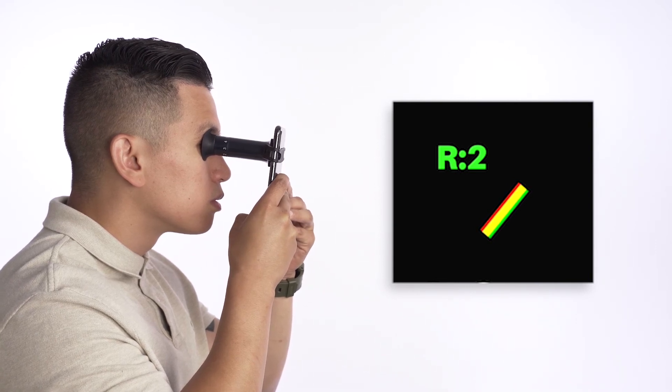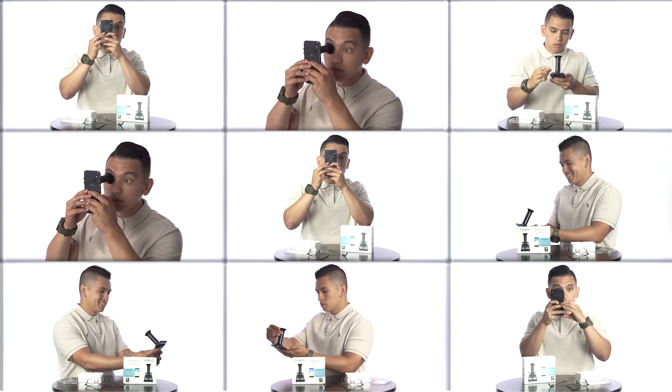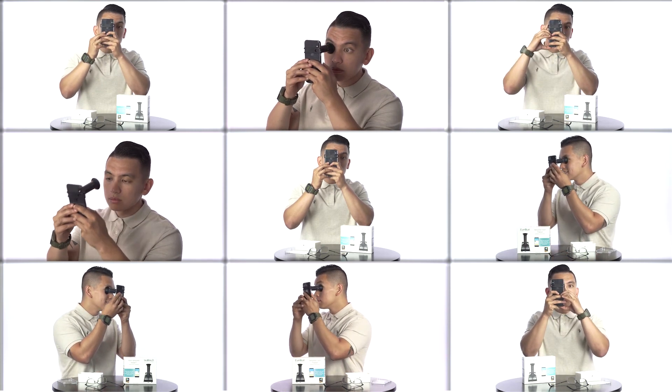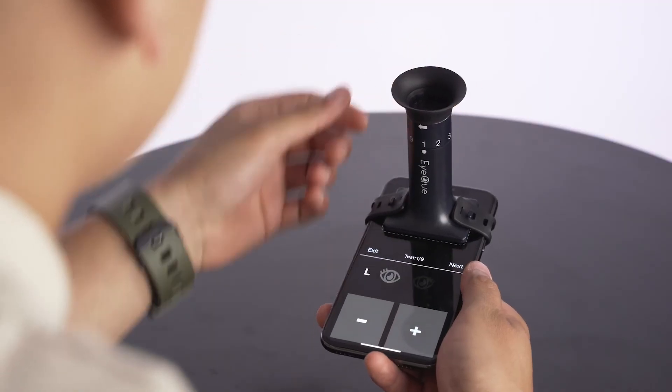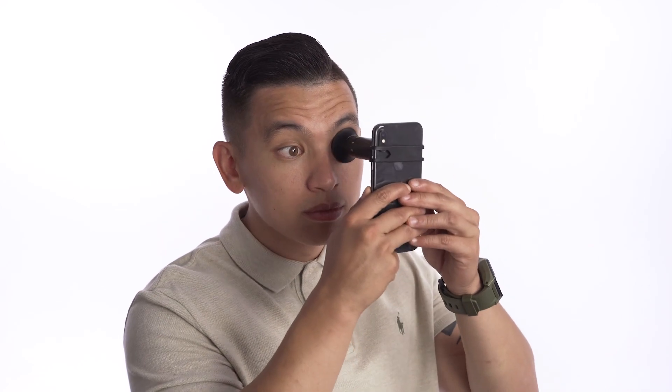Repeat the exercise and overlap the lines to form one solid yellow line. Once you repeat this exercise for a total of nine angles of your right eye, you'll be prompted to switch to your left eye. Reset to Position 1 and continue taking your left eye measurements the same way you did for your right eye until all nine measurements are completed.